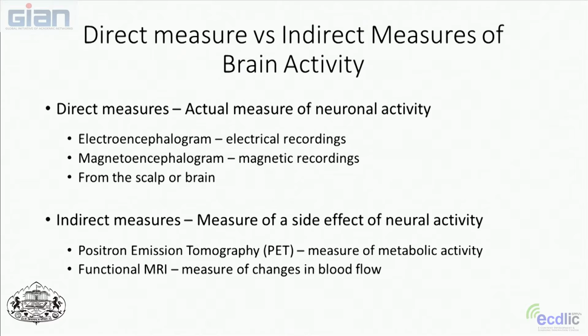In this case, an EEG, which is an electrical recording of the brain, we think is a direct measure of what's happening in the underlying tissues. The neurons are firing, and we're placing electrodes on the scalp, and we're measuring this activity. MEG, which is the magnetic version of EEG, is also thought to be measuring these direct activities that are going on in the brain.